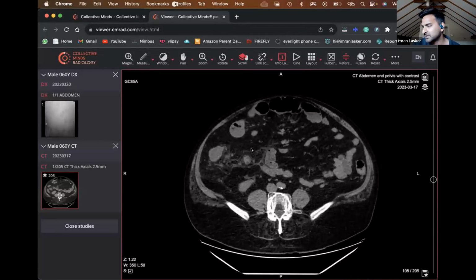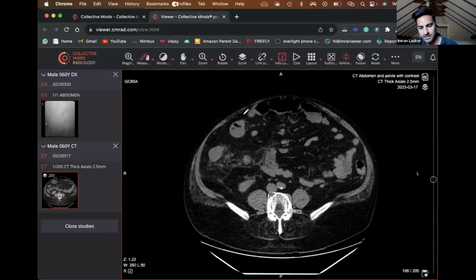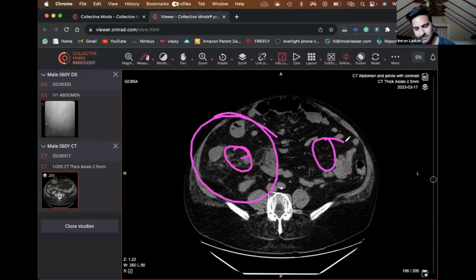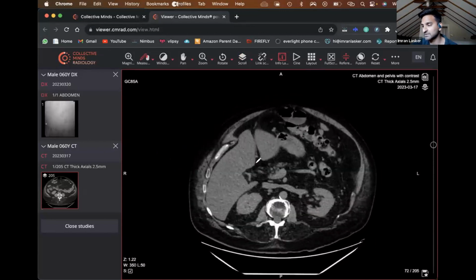So now we've come up to this area, and I don't know if you guys can see this, but this area doesn't look quite right. Can you see that? When you compare this little area here to this, that area looks more cloudy, right? So there's something going on in this area. Even if you didn't see that, I would use this particular way to go through any scan.